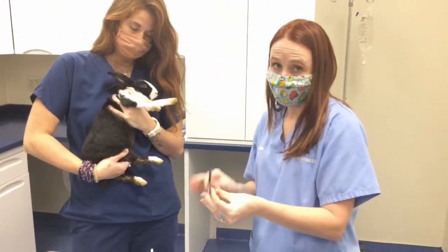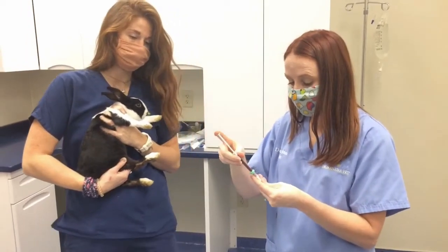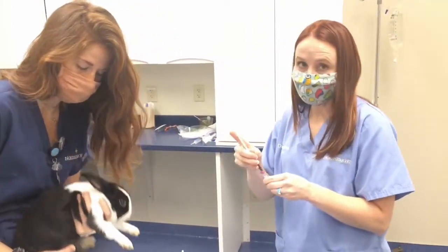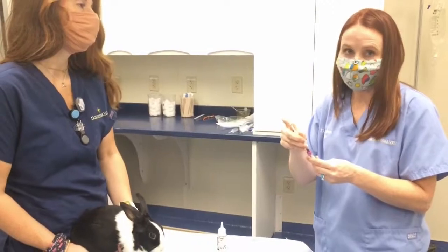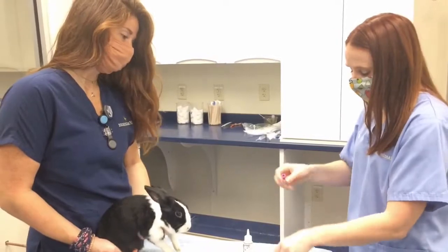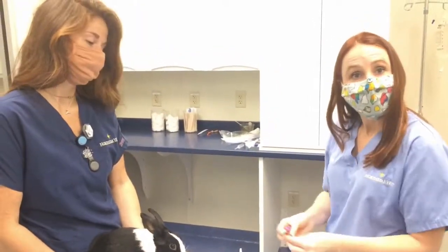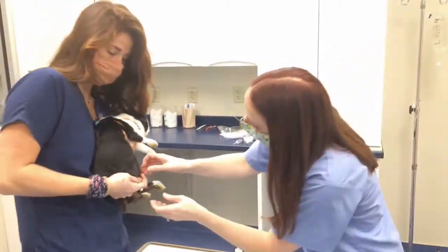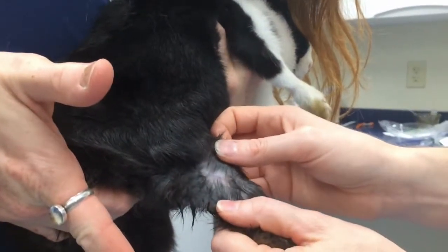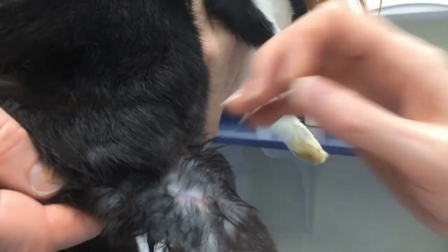Kate is going to continue to hold on that vessel. If you need a Band-Aid, please feel free to put one there — just remember that it will need to come off. When rabbits sit, you won't be able to see the Band-Aid; it's kind of hidden. We've got a great blood sample from Moo and he did very well. We'll check that area and see if he needs a little Band-Aid. Barely even a bruise there — it looks really good and no hematoma. So he's good to go.